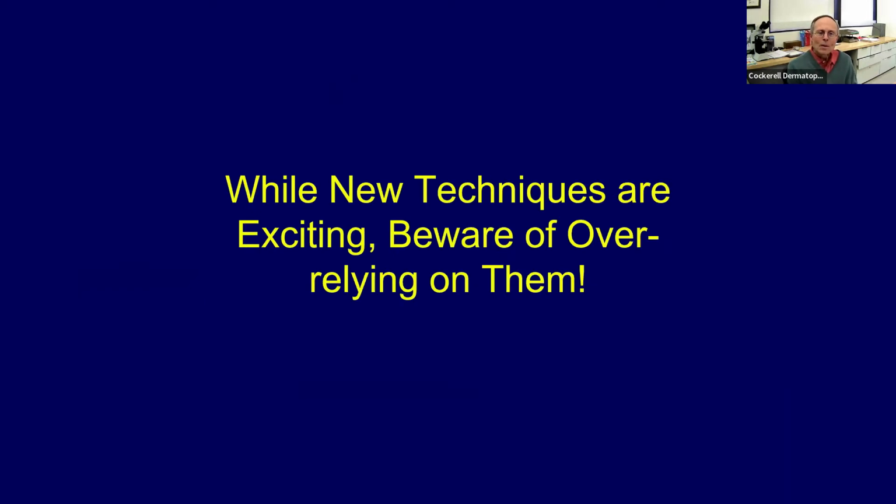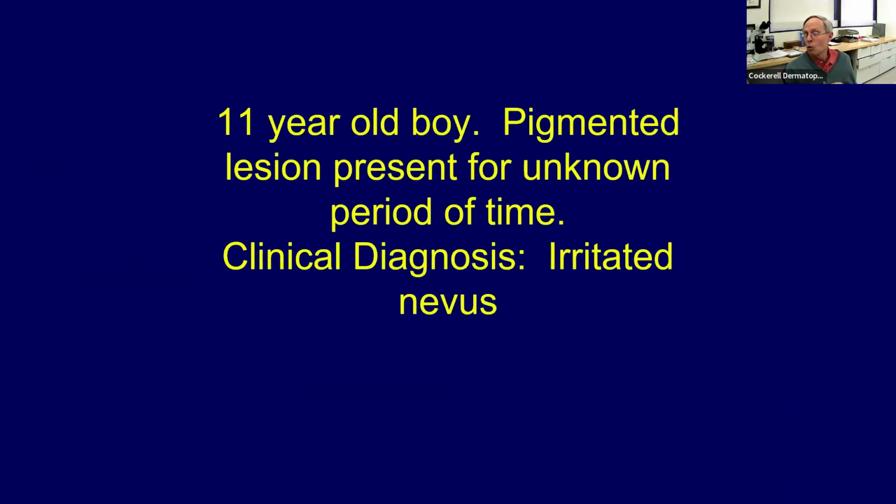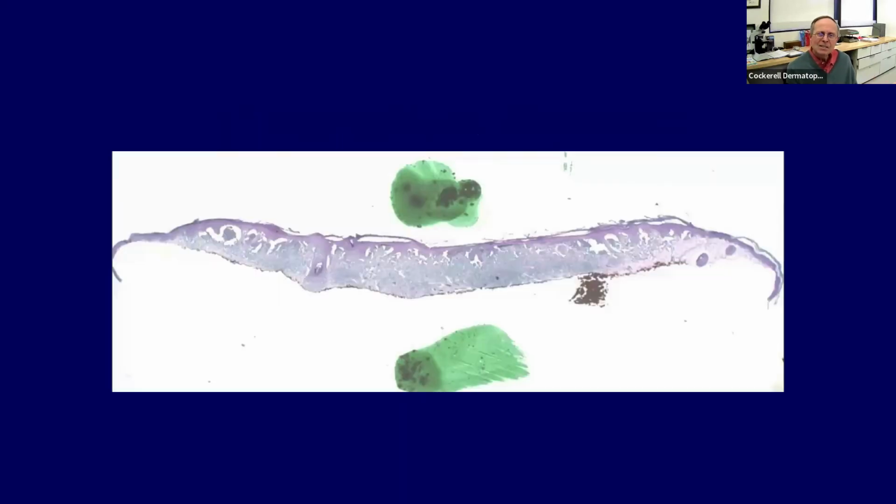And you do have to still be aware of over-relying on these techniques. Again, it's great when they work. It's great when you have a tough case. But when you get a case that's sort of like this one that isn't really that tough, and you start putting these stains and tests on it.